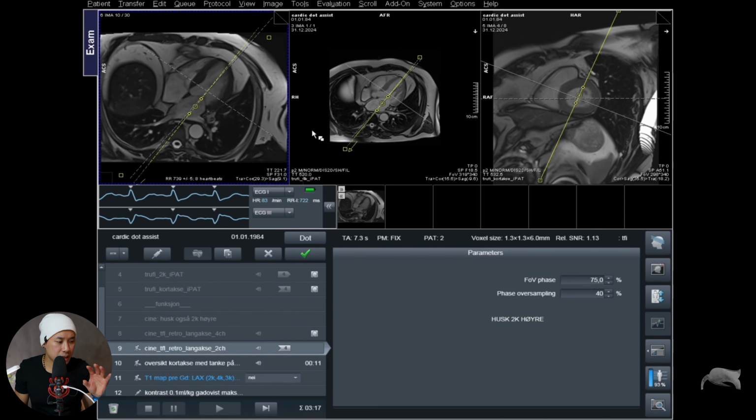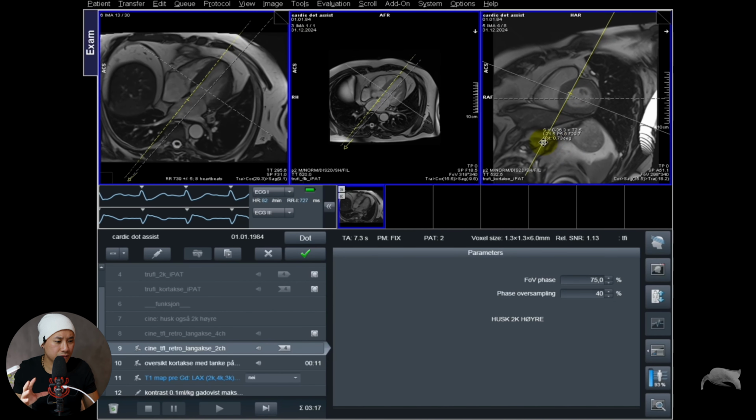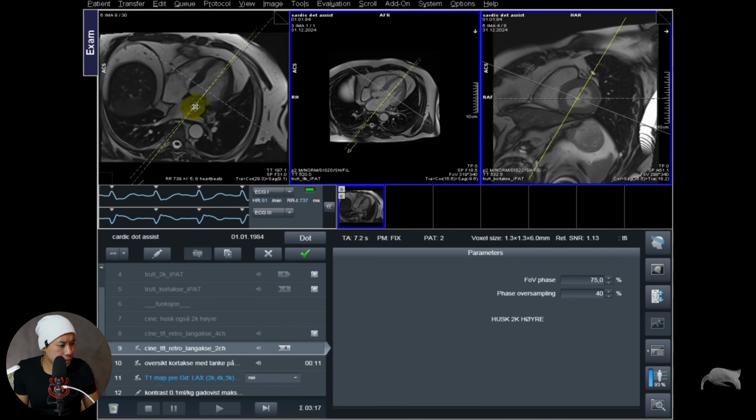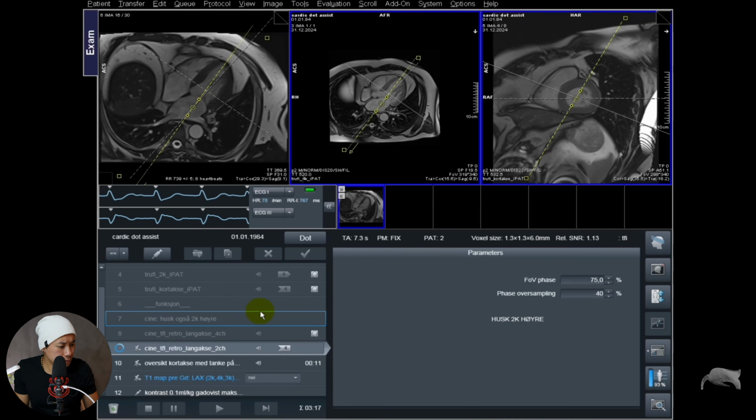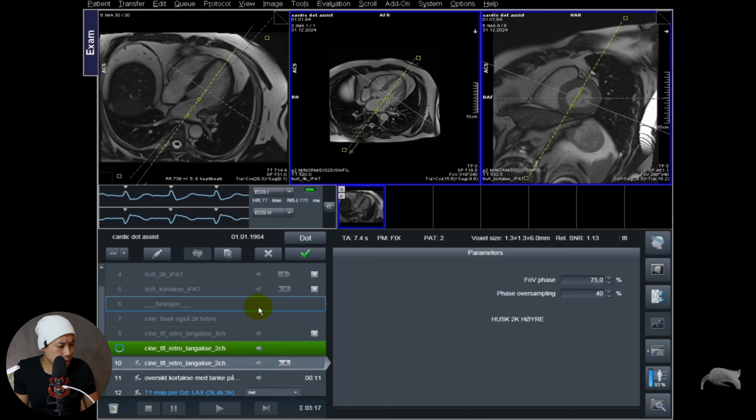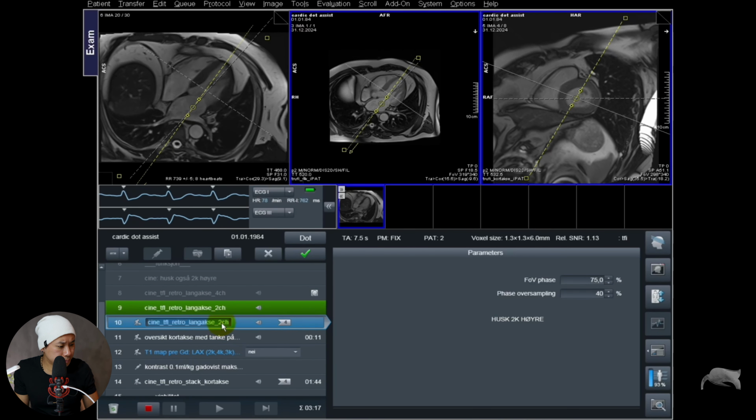You can see the video is spinning, and I will show you also where you can do the settings. It's more like a set and forget. So just do it once and it will be remembered. Okay, just gonna show you here. So it's very cool because you can plan while it's kind of spinning, right? So let's go for there, 3 chamber.